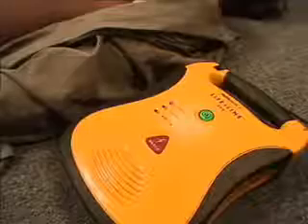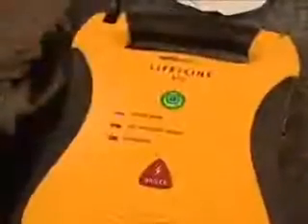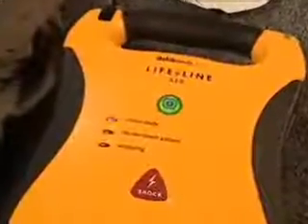Call for help. Remove the pads from the package and back of the unit, and apply pads to the patient's bare chest as shown.